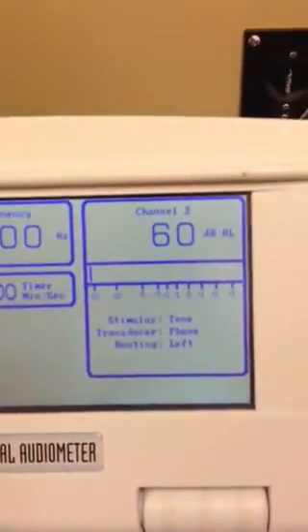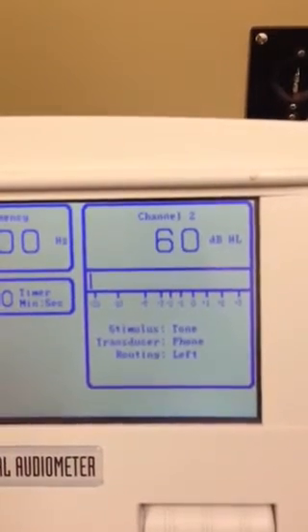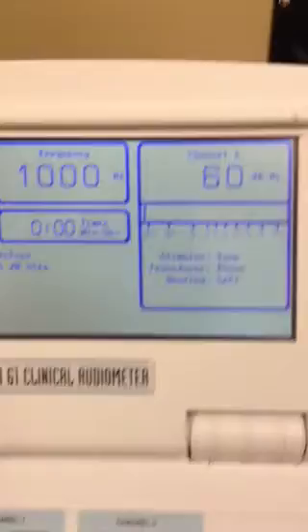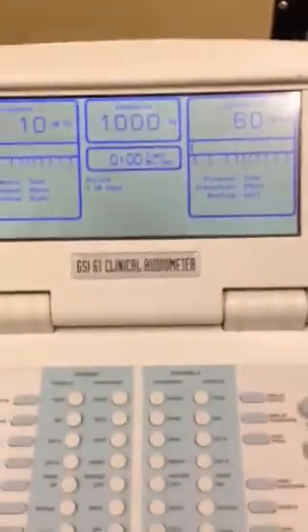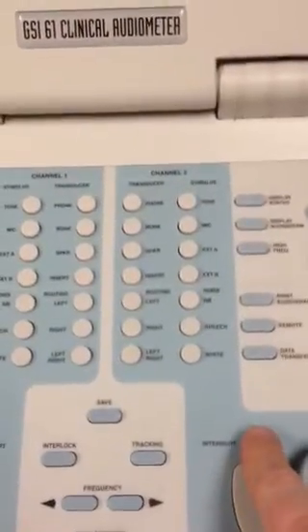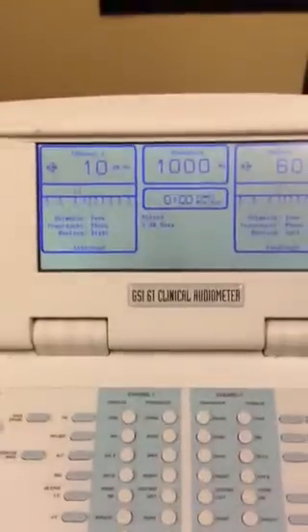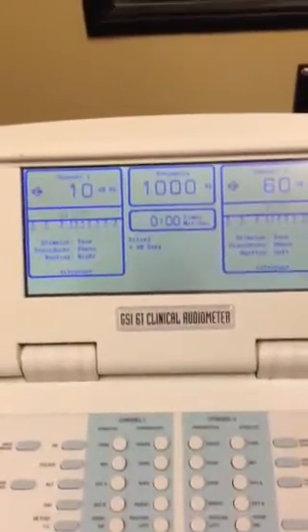On the left side, you have the level at 60 dB HL, with the stimulus as the tone and transducer as the phone as well, so that you can listen on the other side of the booth. You want to press the interrupt button on either side — at that point you are set to listen.